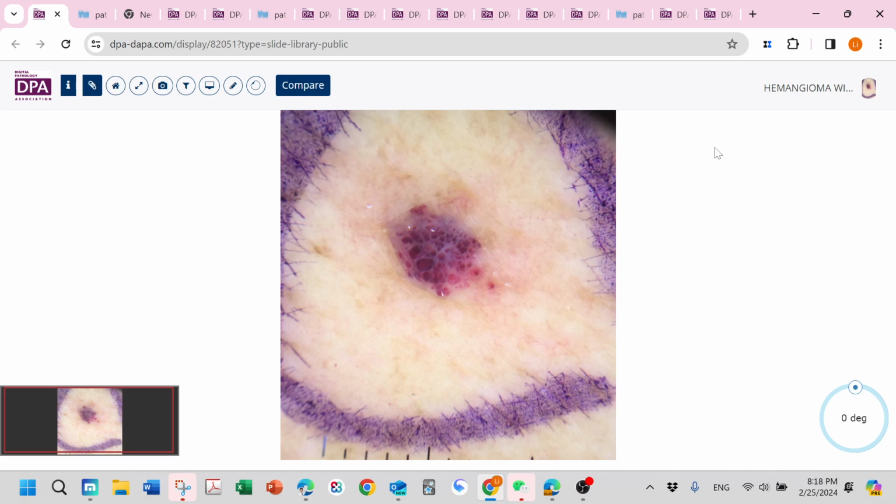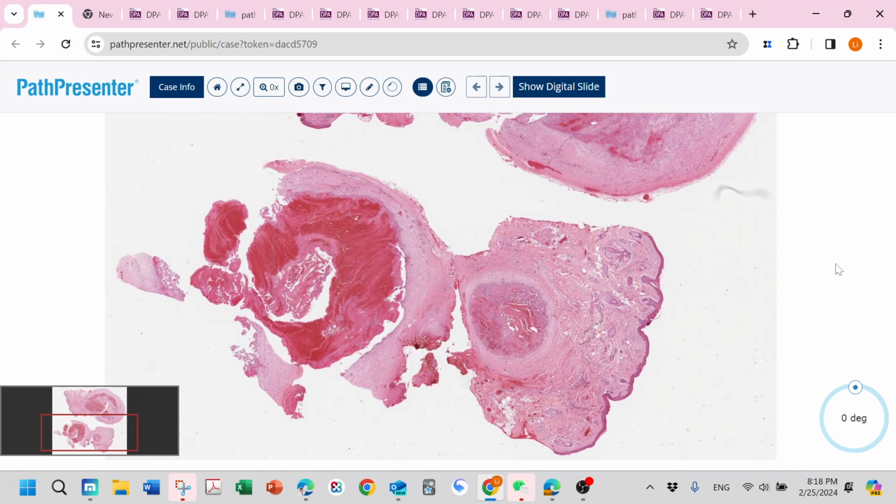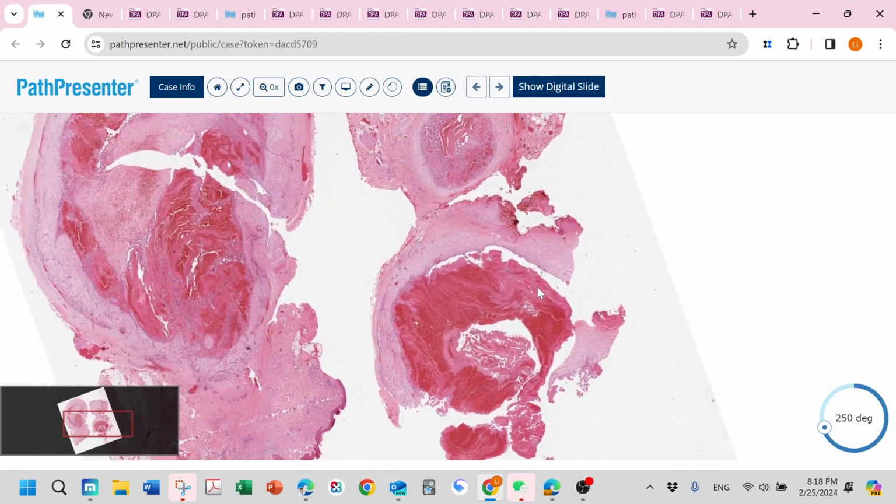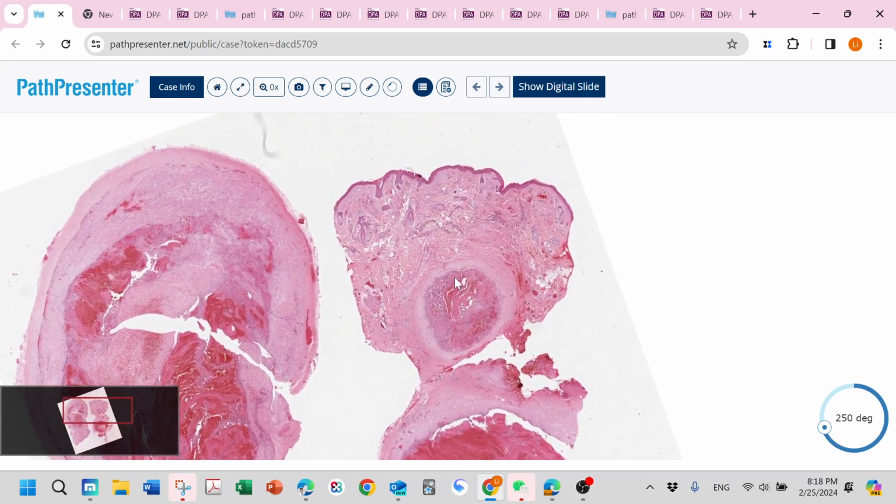This one is Masson tumor, aka papillary endothelial hyperplasia. This is another reactive lesion, but you can see in this low power, we can see this vascular lesion, tons of dilated big vessels with thrombi. Actually, this is a truly reactive hemangioma. We even have a name, Masson tumor.